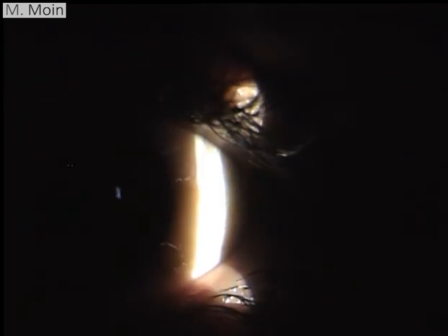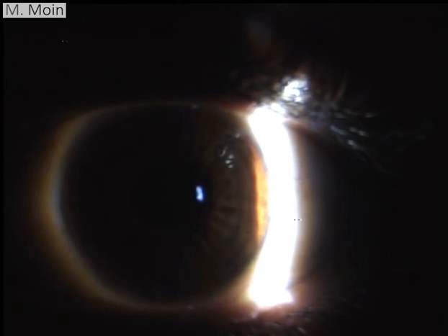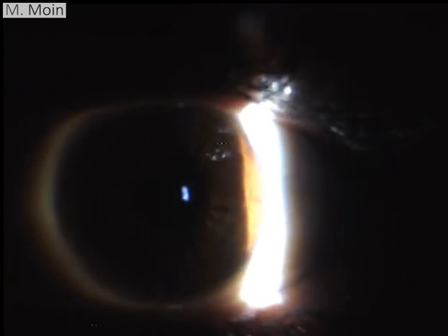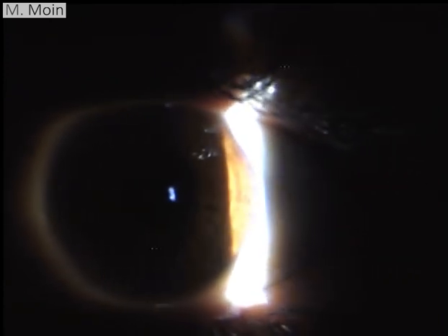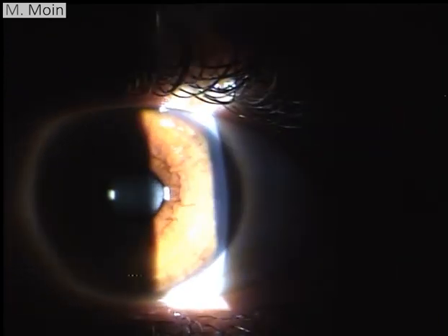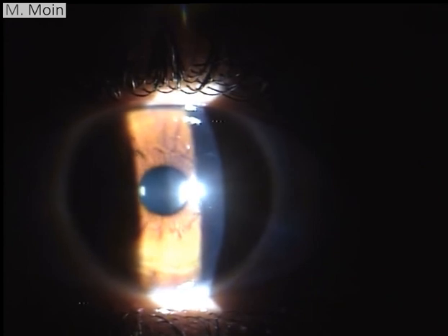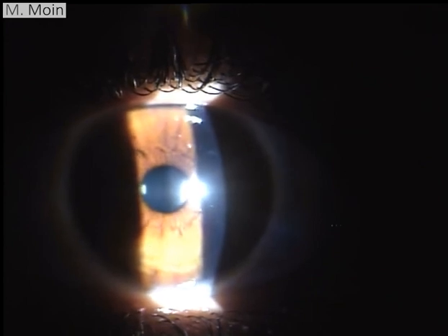We go to lower magnification for a diffuse illumination of the whole cornea. You can also do scleral scatter, which I'm trying to do here - you need to angle the illumination beam from the side so that you can get a good view.